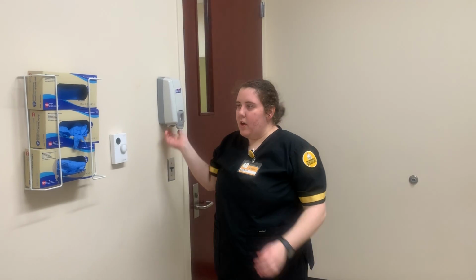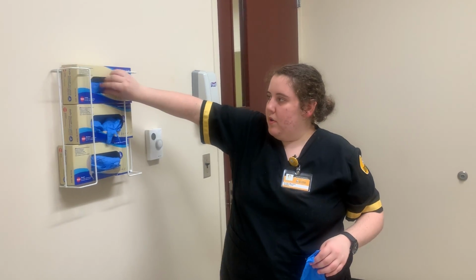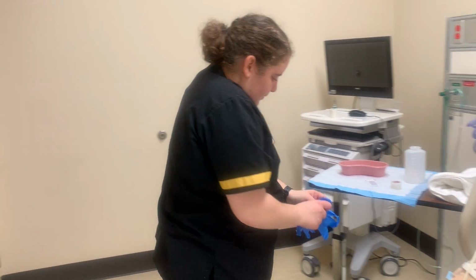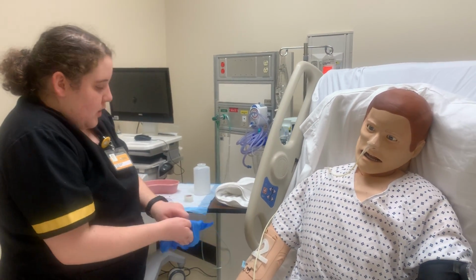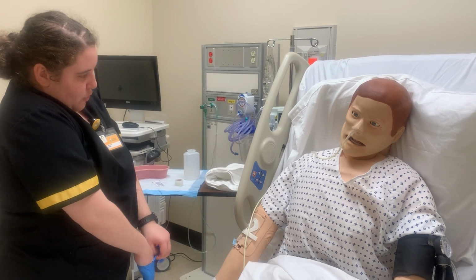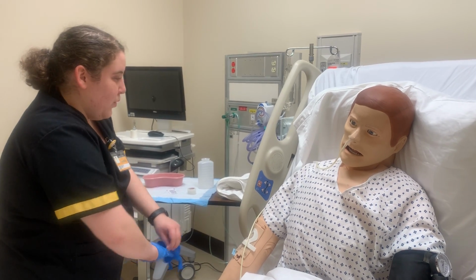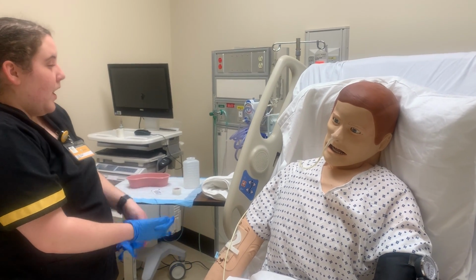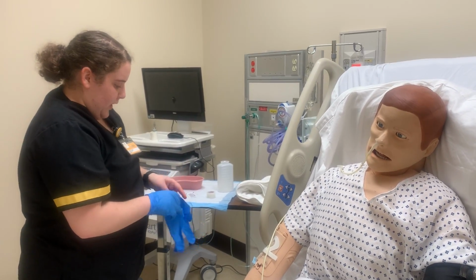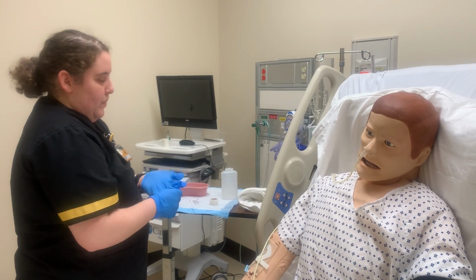Hello, I am back. I have some good news. The doctor has given the order that we can take the NG tube out. So I'm going to just put some gloves on and we can get started. The process for this one is a little simpler than putting it in, but it might be a little bit more uncomfortable for you because it will involve some residual from your stomach coming up with the NG tube, and it will feel like you are throwing up, which might actually make you throw up. So I have this spit basin right here for you if you would need it. I'm also going to put the towel back on you. That way, again, if a mess is to be made, it will be made on the towel and not you.